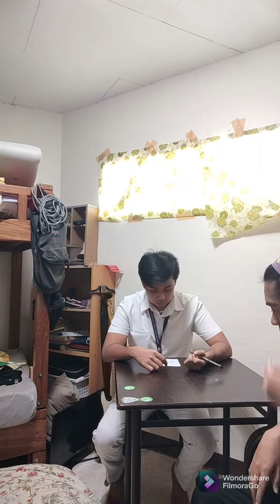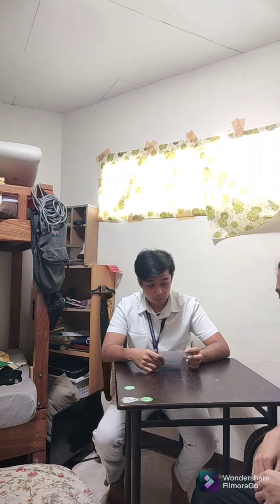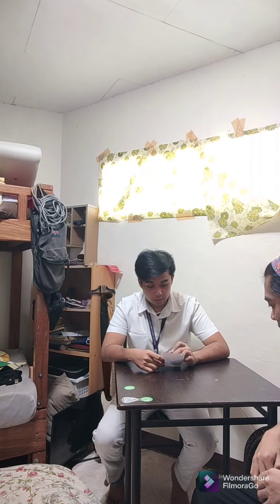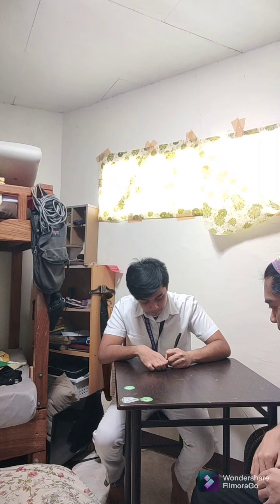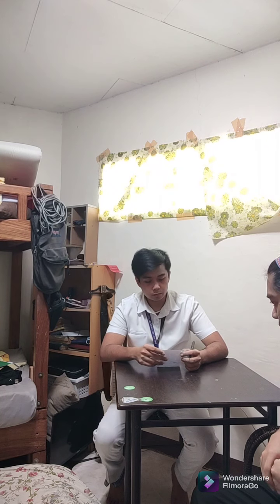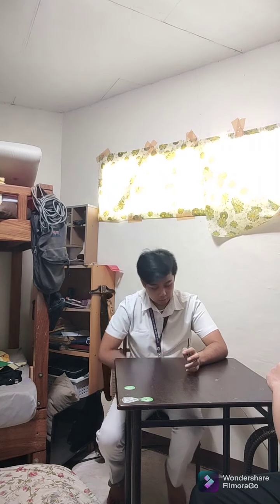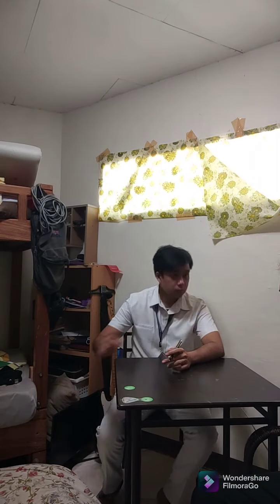So, first, sir, bago tayo proceed is, ang name nyo po, paki-state. Muhammad Said Dataya. And ang age? 19 years old. Ang birth date? October 31. Okay. So, ang procedure po na ni-request dito, sir, is shoulder. Opo. So, bakit po yun, sir? Anong is the chief complaint? Bigla lang po siguro sa pag-stretch. Pag-stretching. Okay. So, mga ilang days na ba yun, sir? Weeks or months? Matagal na po? 3 days po, bago na.